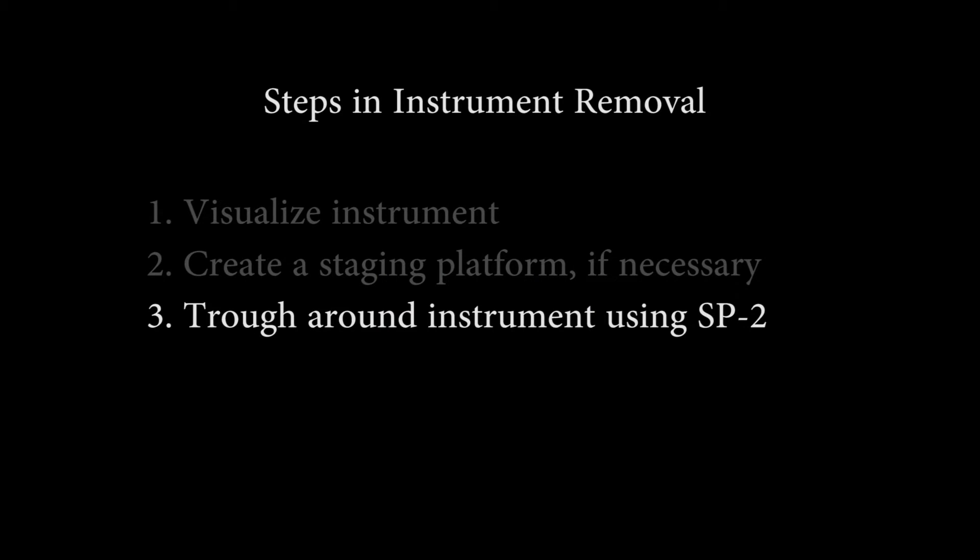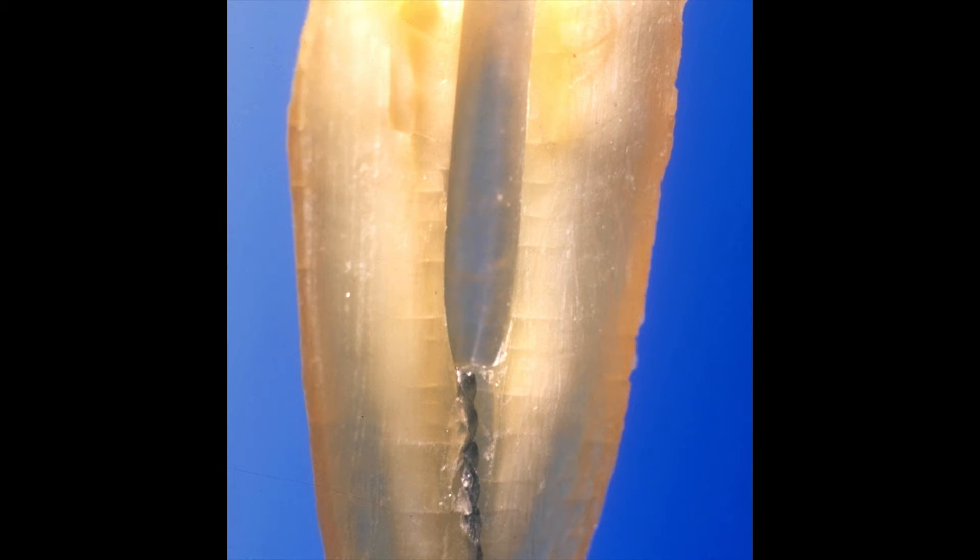Step three, trough around the instrument using the SP2. Do not touch the instrument with the ultrasonic tip. Try and just trough around the side of the instrument circumferentially, creating a nice circular trough around the instrument.